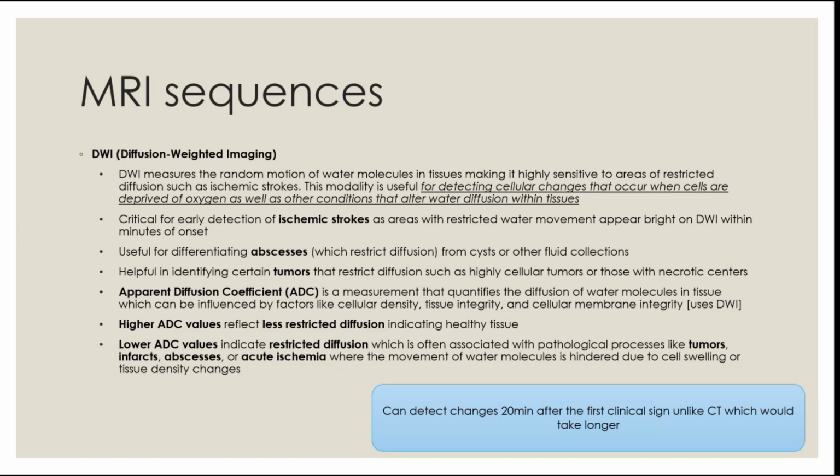It's easier to use this compared to the CT, because sometimes this can work faster than a CT if you're trying to find any restricted diffusion.